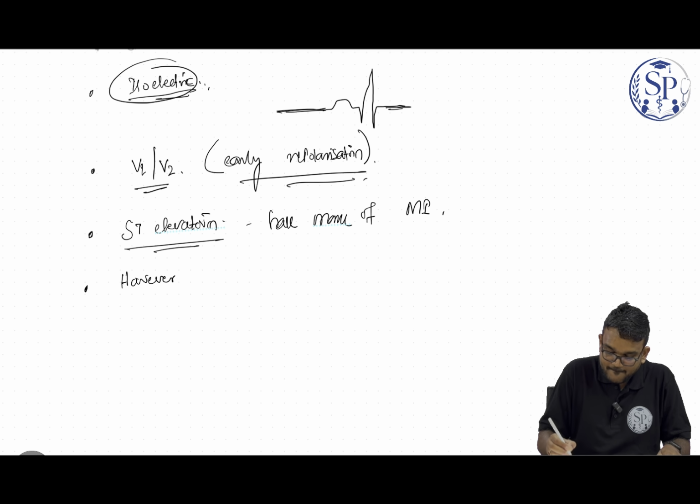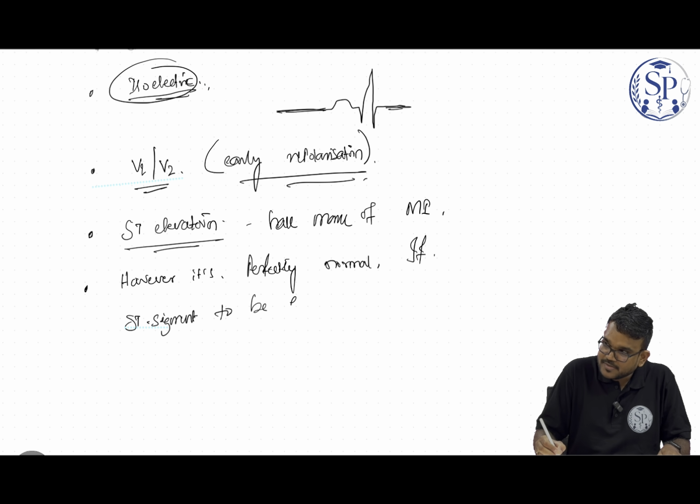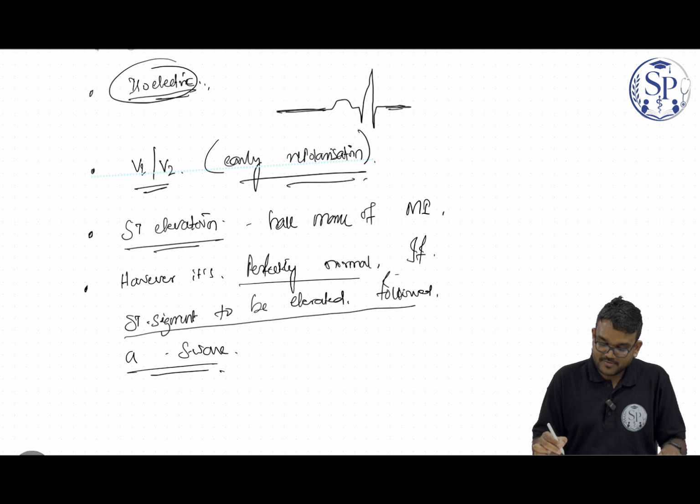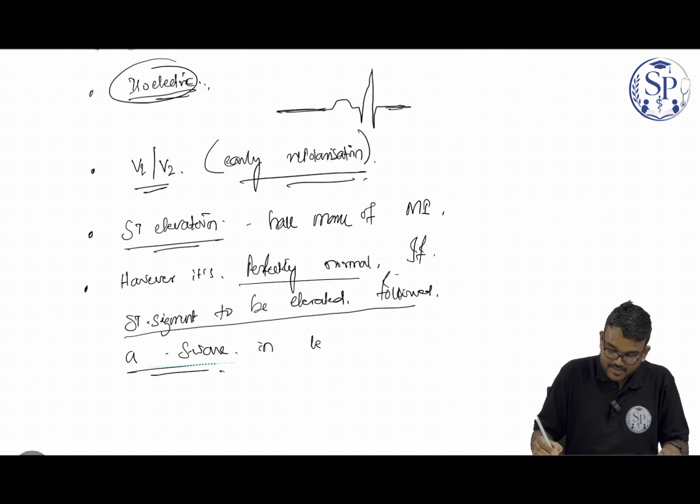However, ST segment elevation is perfectly normal if the elevated ST segment is followed by an S wave in leads like V2 to V5.